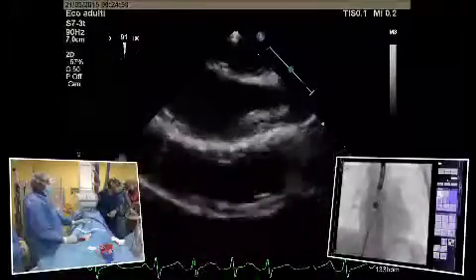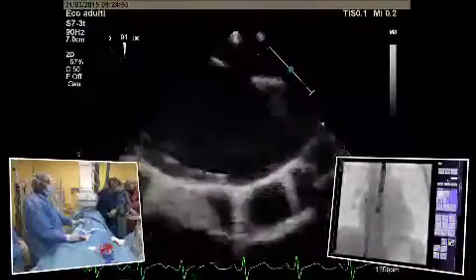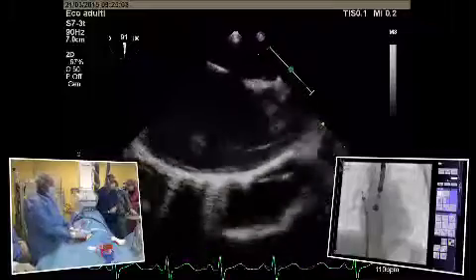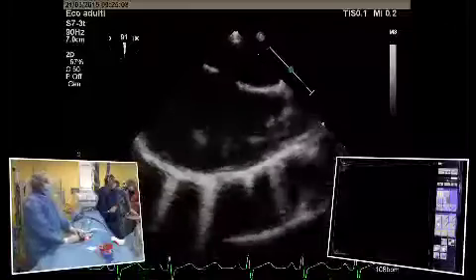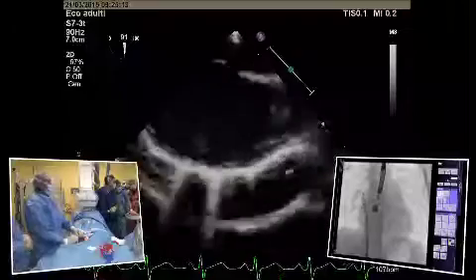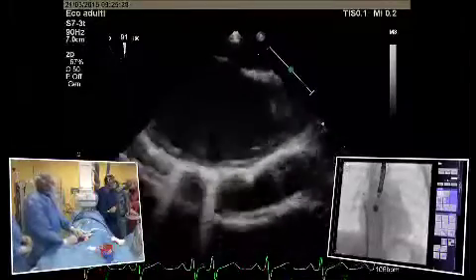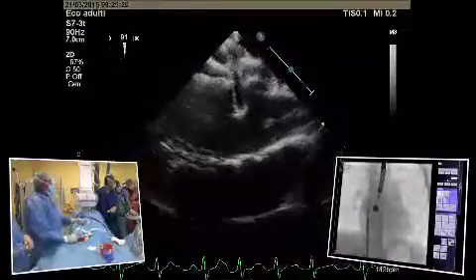So what I can do is go into the right upper pulmonary vein. Can you see that in fluoro? Yes. This is a technique when the device tends to slip through the defect. Deploy the device from the right upper pulmonary vein rather quickly, and we will see. Stay in that projection, Aki, if you don't mind. Okay, here we go.